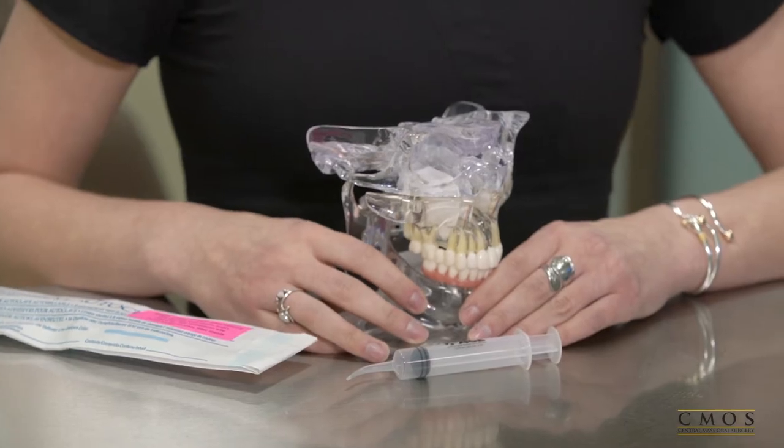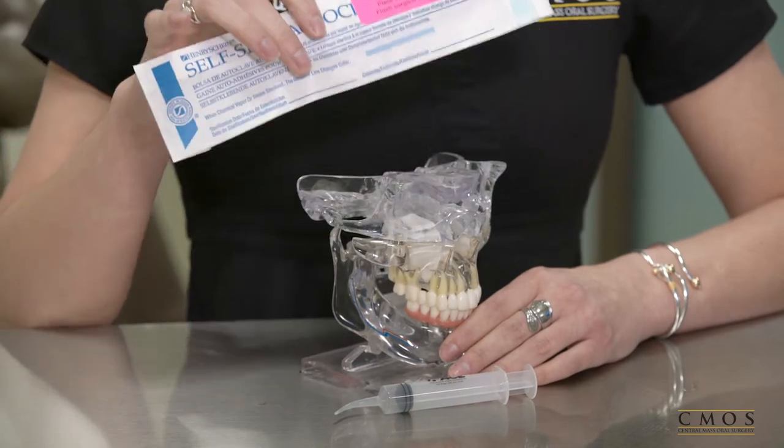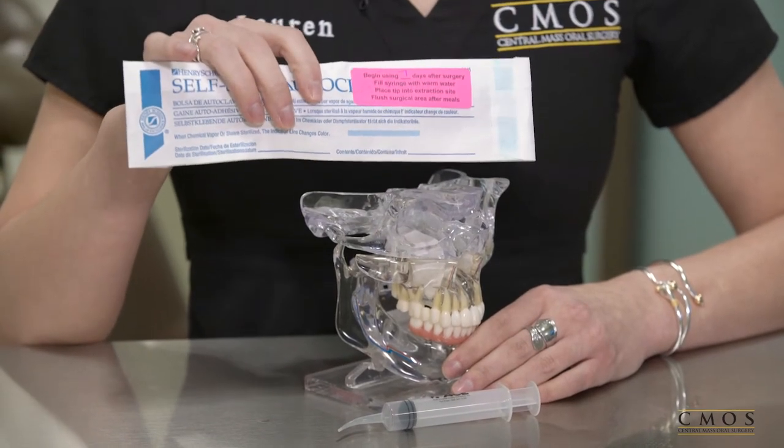In this video we will discuss the post-op use of a hook syringe. Following your procedure, you may receive instructions to use a hook syringe to clean out the extraction sites. In your bag you will find a hook syringe.